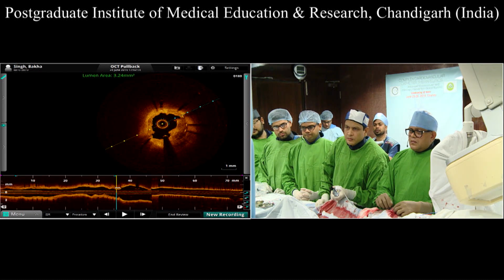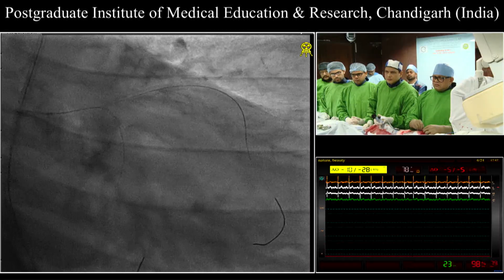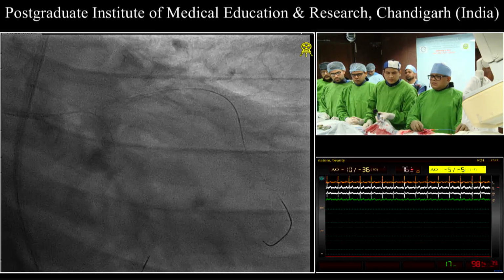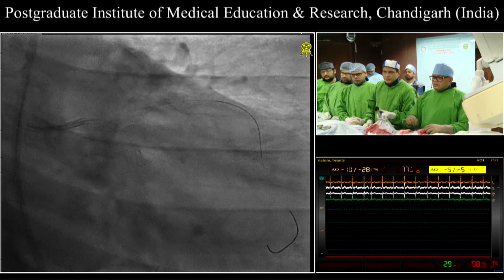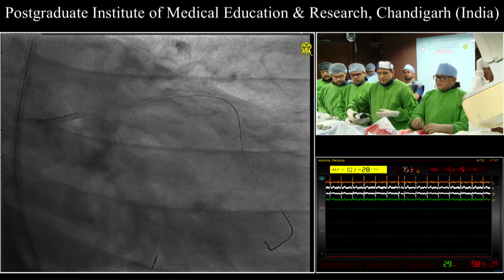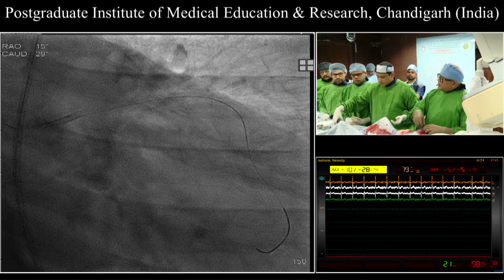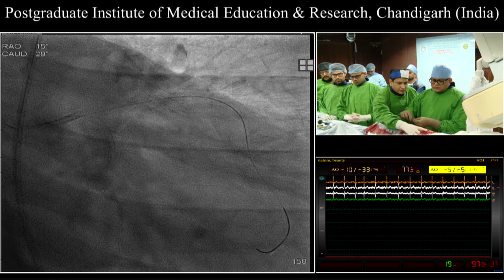If you can really verify that you have multiple dissections into the plaque and you have a good expansion of the old stent, then we don't know at this time, but it's a very good chance that implanting a new stent will be superior to drug-coated balloon treatment in those cases. Drug-coated balloons should probably, in the future, where we have a much better evaluation of these cases, be used after you remove the plaque material, and then you could face other choices. Give me that 3 millimeter balloon.